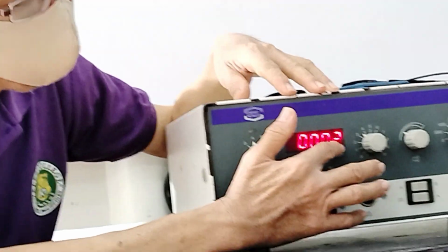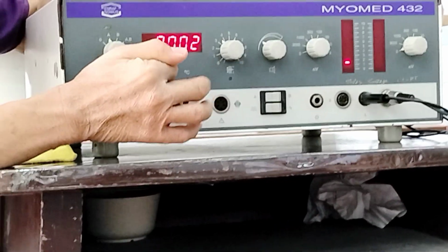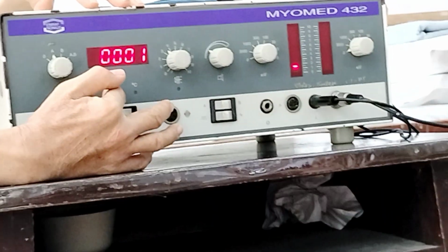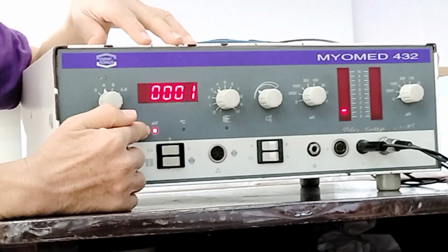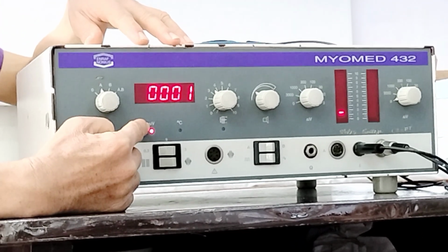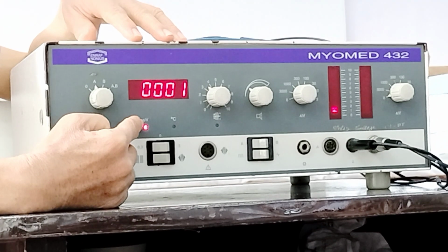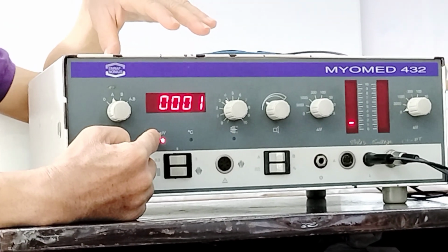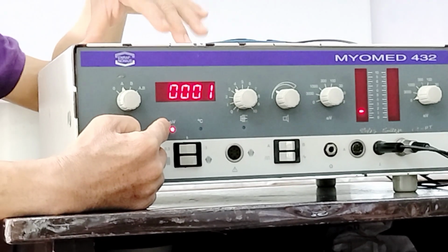And with regards to the values there, the units would depend on which light is on here. If the microvolts symbol lights up, that would indicate that the machine is getting some action potential signal.